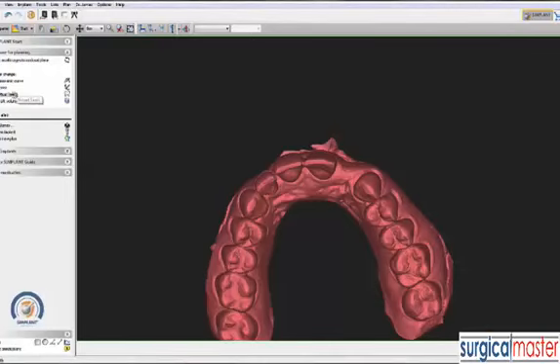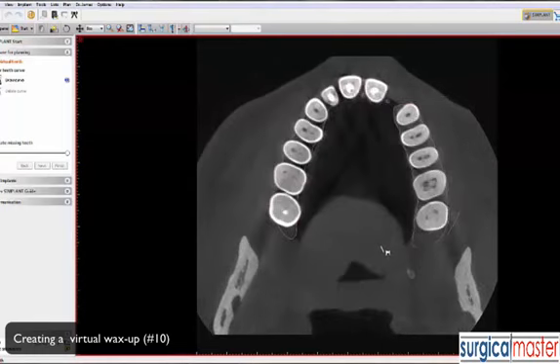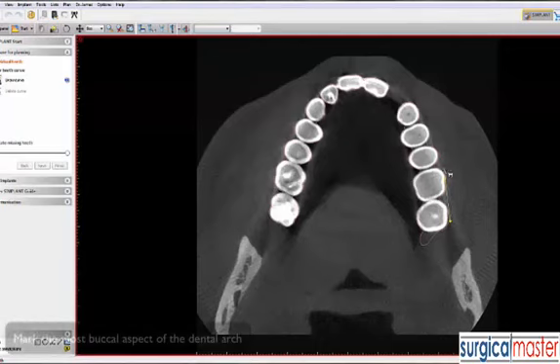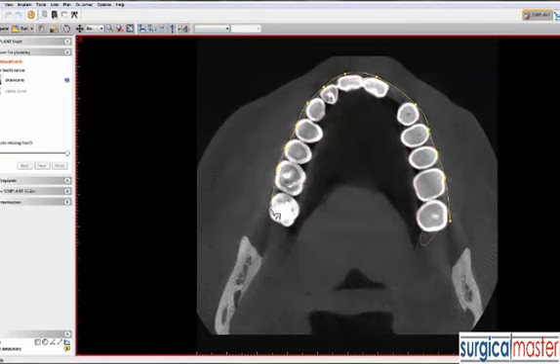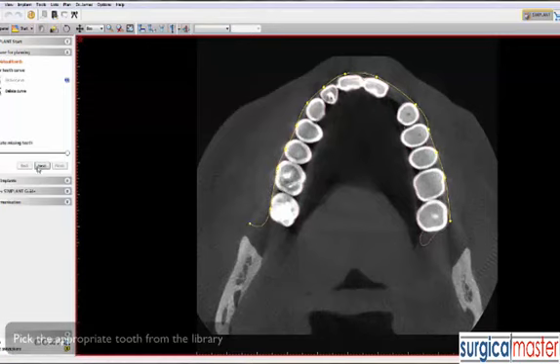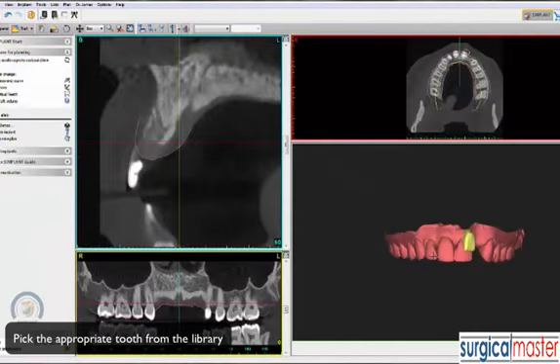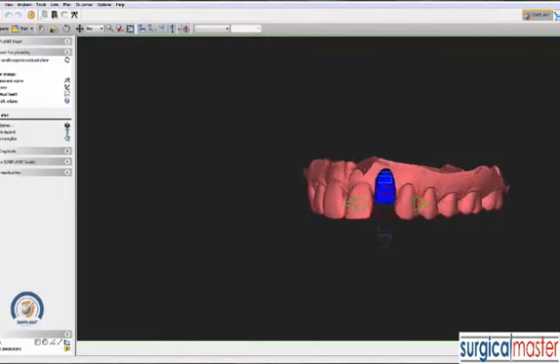The first thing we need to do is create a virtual tooth — a virtual number 10. The software asks us to mark the most buccal aspect of the existing teeth so it can create the right tooth almost in the right position. We create a little arch here and choose the number 10 tooth. It roughly places it in position, and then we need to make some adjustments — obviously the tooth doesn't fit there yet.